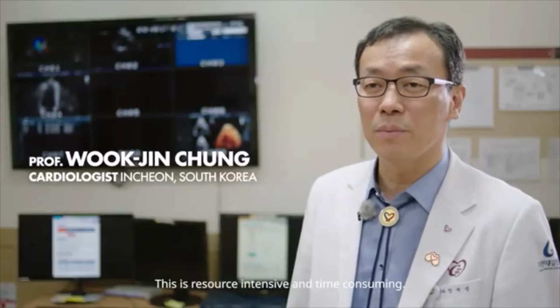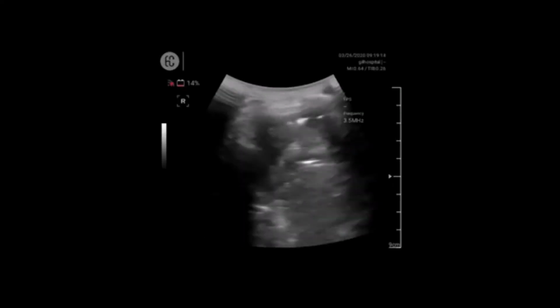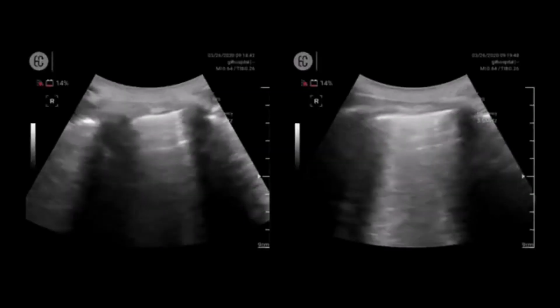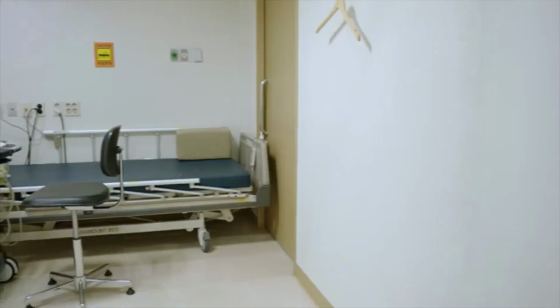So what happens in pneumonia is that inflammation of the lung takes place. There is accumulation of fluid in the interstitial spaces. These are all things which you can see in real time only with the help of ultrasound.